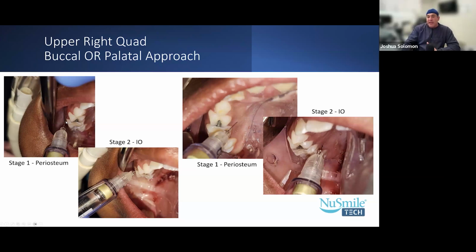The reason is it is much easier to accidentally slip and bump into that periosteum. And if that patient doesn't have complete local anesthetic delivery ahead of time, you're not going to have a happy camper. So especially with children, I would recommend not going at this angulation.